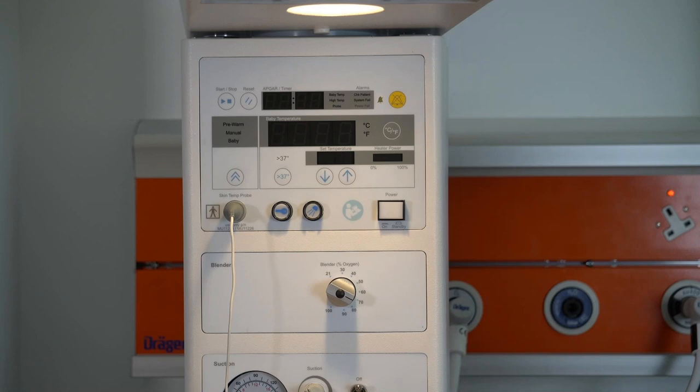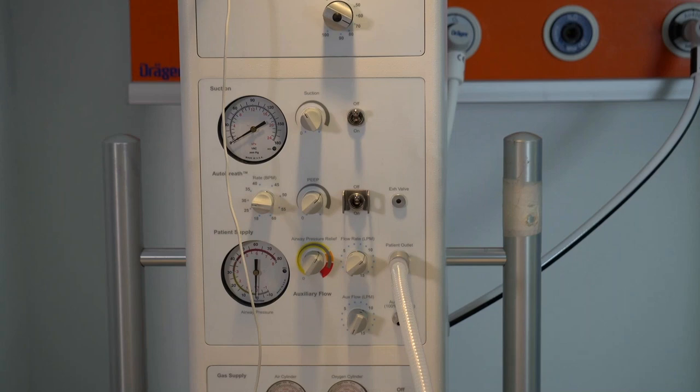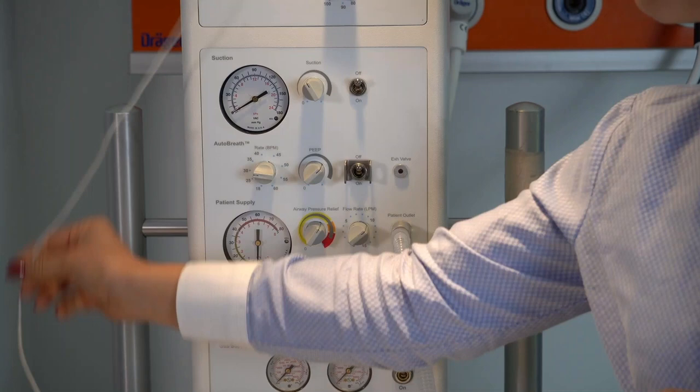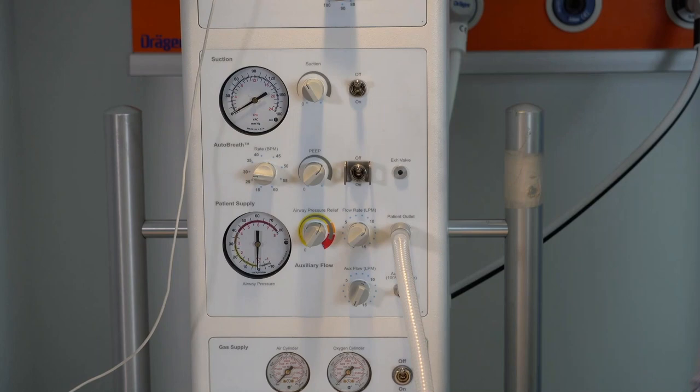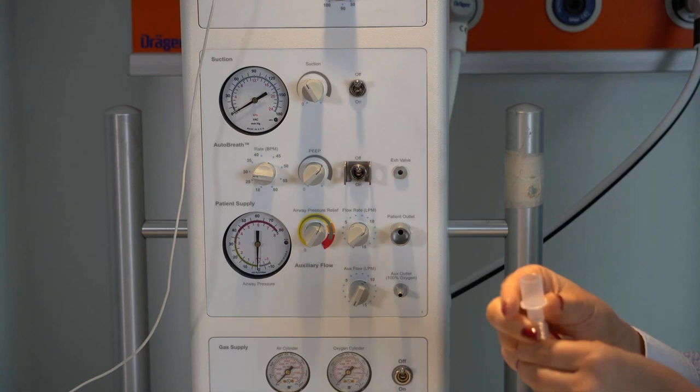Then if we move on down, we are going towards the actual resuscitation module. So I'm going to move this a little to the side. So we have the integrated suction, which is extremely important during resuscitation, especially if we have a meconium aspiration syndrome or if we need to suction the baby. Also, we have the patient's supply information, so the connection to the patient outlet. So this is how our standard circuit looks like.